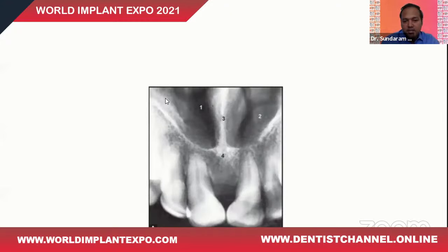This is yet another picture where the angulation is not proper, but you could see other precise anatomical features. 1 points to the nasal fossa, 2 points to the inferior nasal turbinates, 3 would be the bony nasal septum, and the most radio-opaque region, the anterior nasal spine, is also seen.